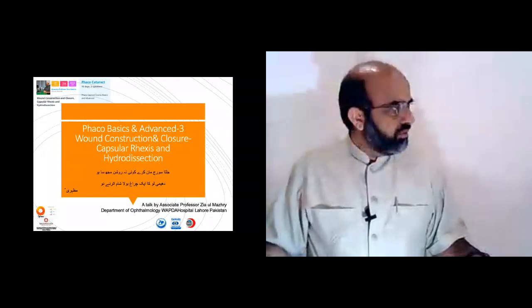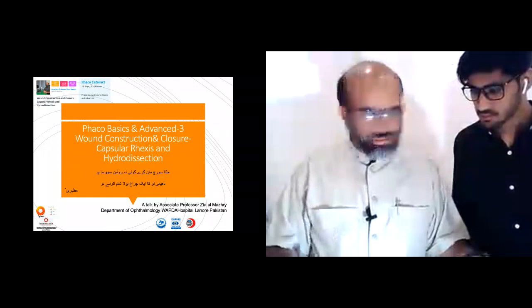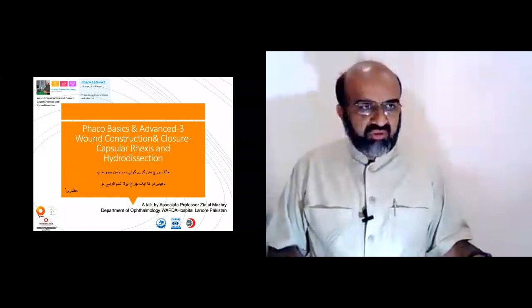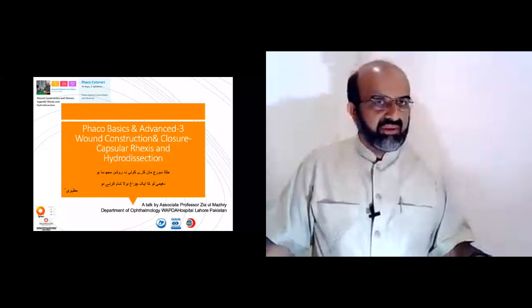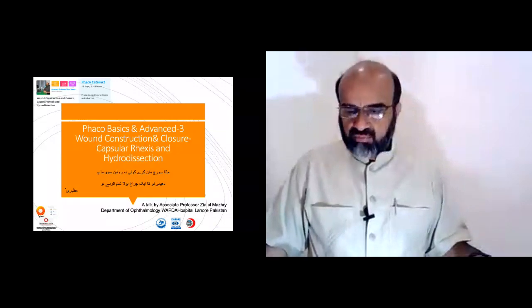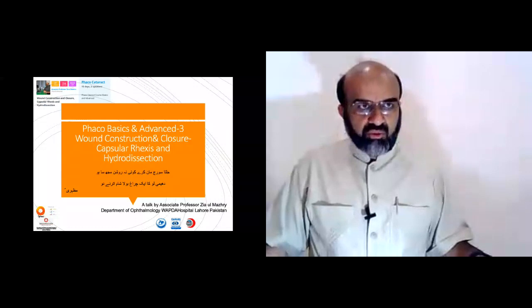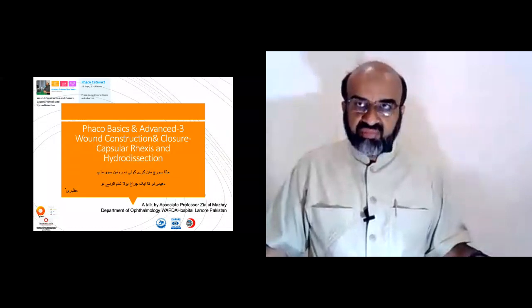And in the previous 2 lectures, we have discussed phaco with the name of Know Your Machine. And then we discussed how to minimize surgeon-induced errors and the role of the non-dominant hand in phaco cataract surgery. And we are going to build upon it with wound construction, closure, capsular rhexis and hydrodissection techniques.